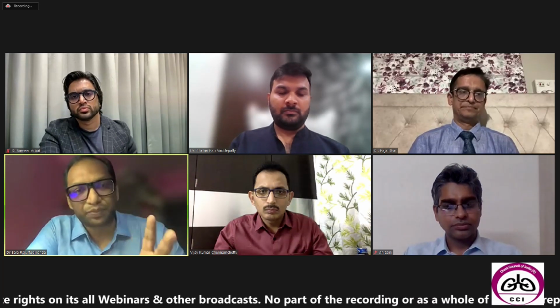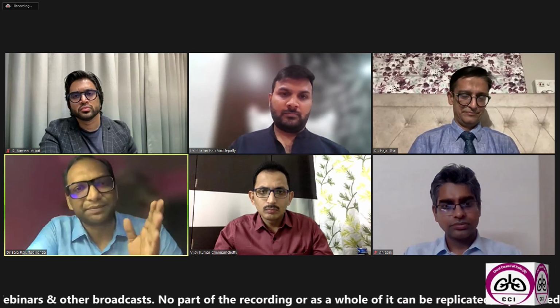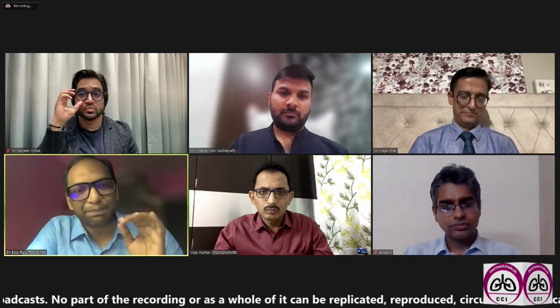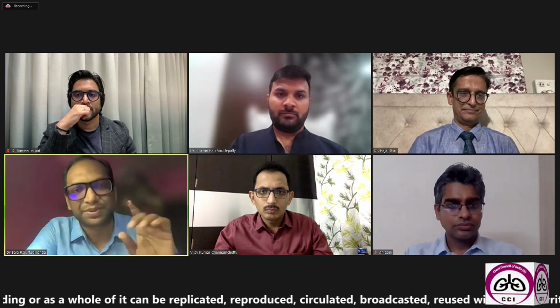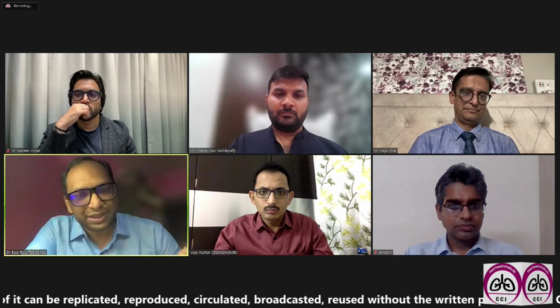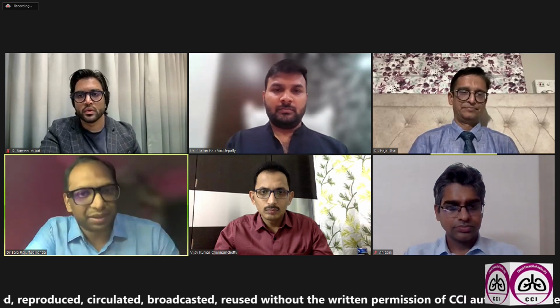So that's point two. And point three, what I want to tell about this is, if you encounter bleeding, please don't panic. Bleeding is a must. Definitely there will be a bleed. Please get ready. First procedure or second procedure, you do a cryo lung biopsy, there will be a bleed. Please don't panic, because always remember what Chetan has said: always have a backup plan, get a second balloon, or put another endotracheal tube inside the rigid barrel. So these are the techniques to be followed.